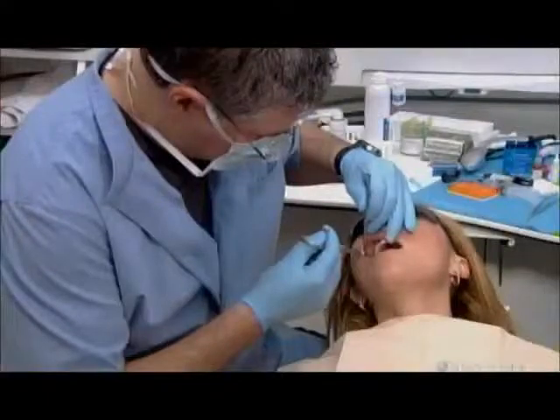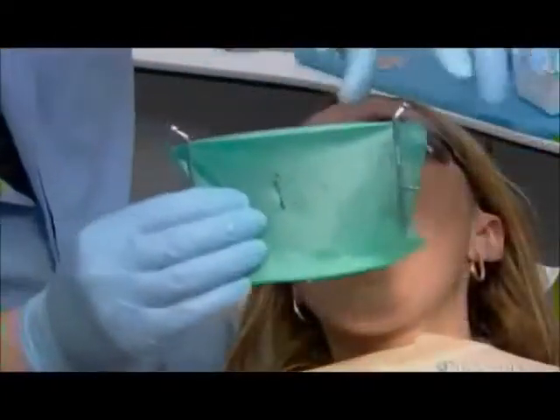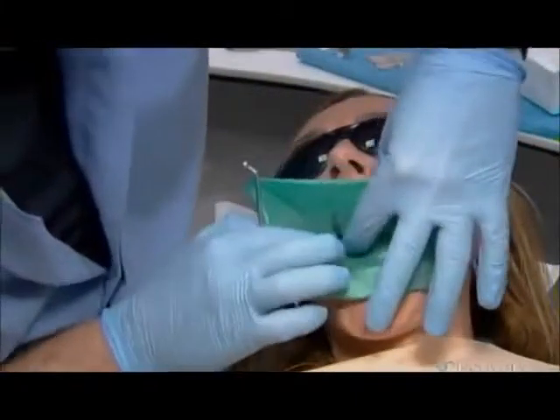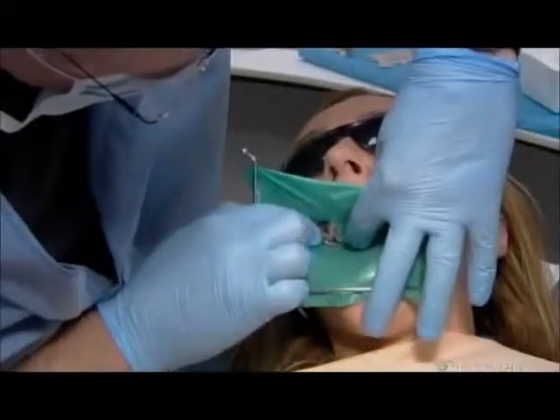He anesthetizes the tooth and the gums that surround it. He then stretches a rubber dam across her mouth and exposes the area to be treated through a slit. This keeps filling fragments out of the patient's mouth as he drills.